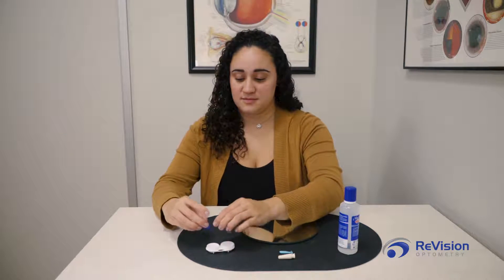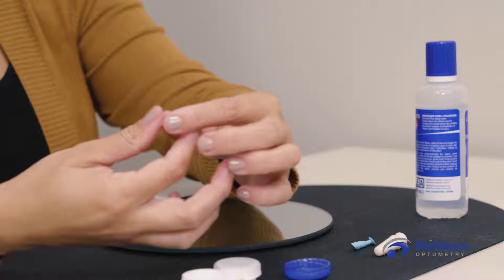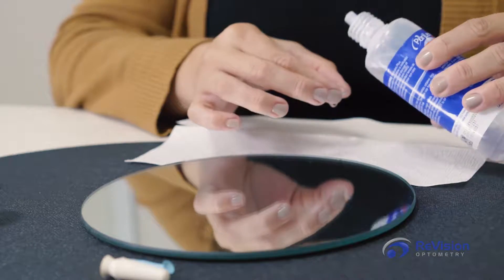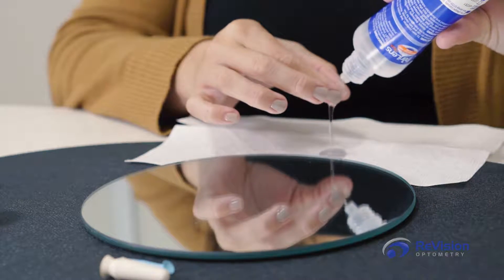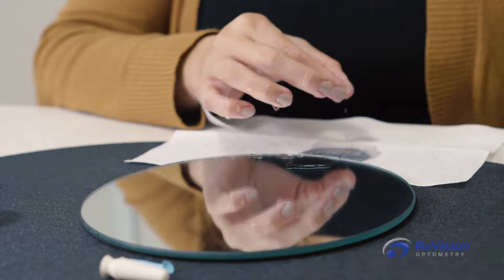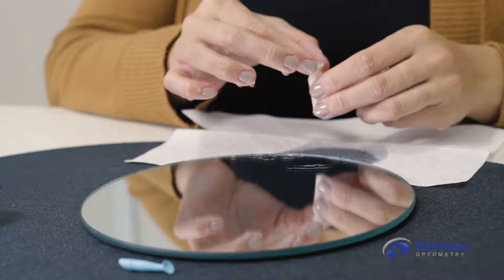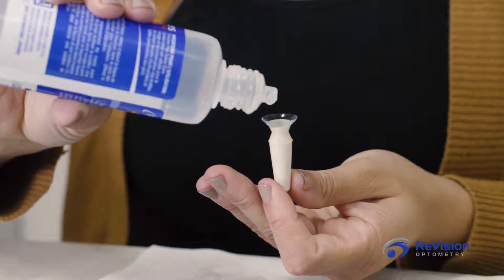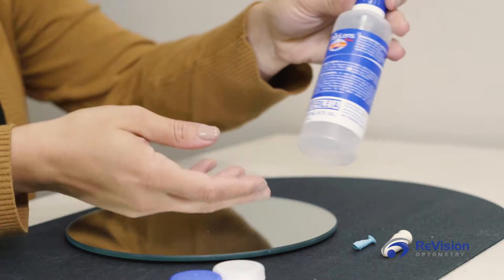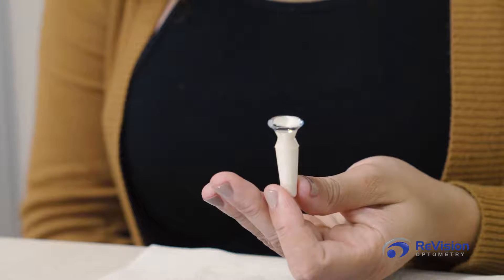Remove the scleral from its case. Rinse the lens of any dust, debris, or particles that may irritate the eye. Place the scleral on top of the plunger, holding the plunger in a vertical upright position. Do not squeeze the plunger while holding it. Fill the scleral up completely with preservative-free saline — you'll notice the solution becomes rounded as you almost overfill the lens.